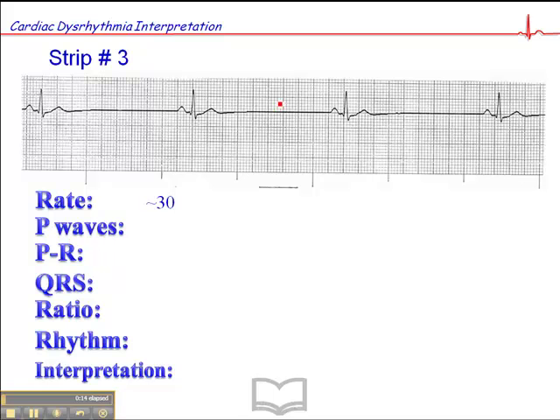We'll do a manual calculation here. So here's a QRS that falls on a dark line. So the heart rate is 300, 150, 100, 75, 60.